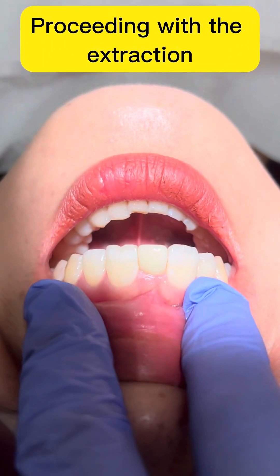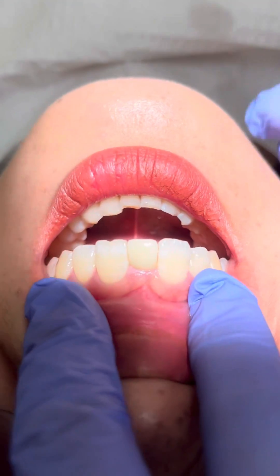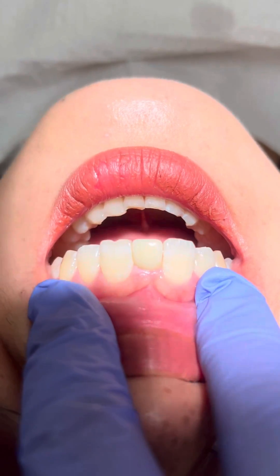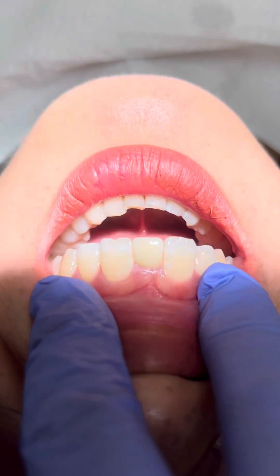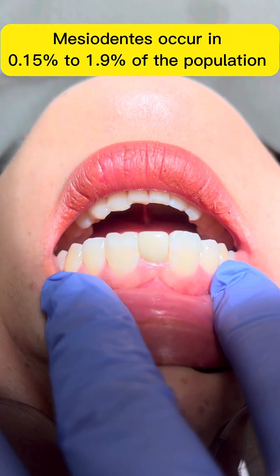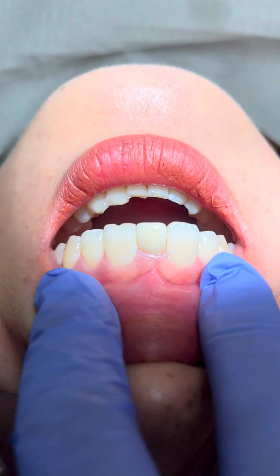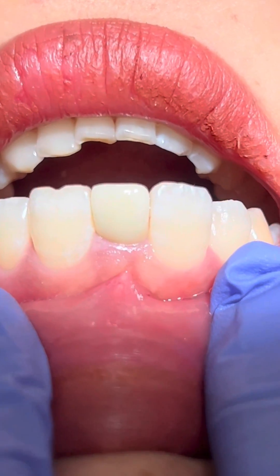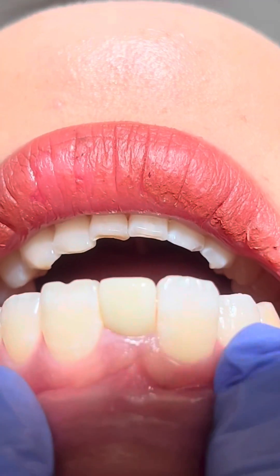Now that the area is numb, we will proceed with the extraction. Mesiodens are the most common supernumerary teeth, occurring in 0.15% to 1.9% of the population.